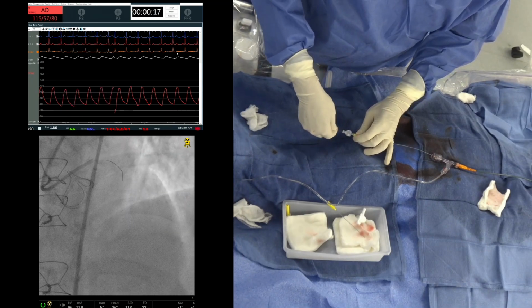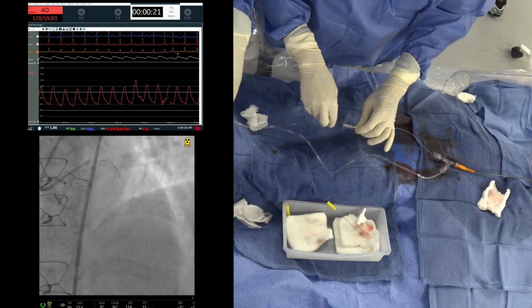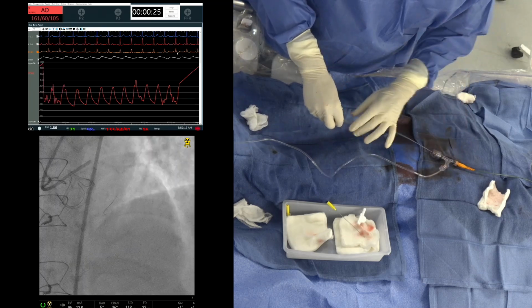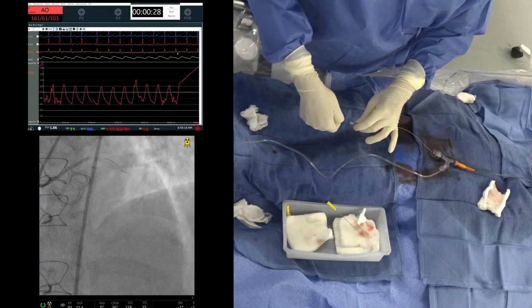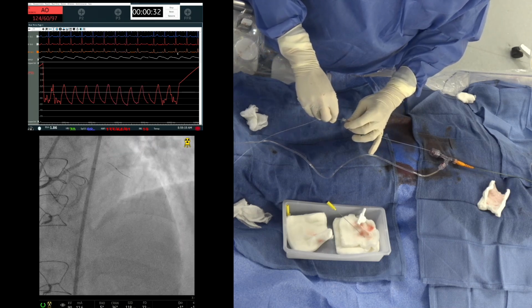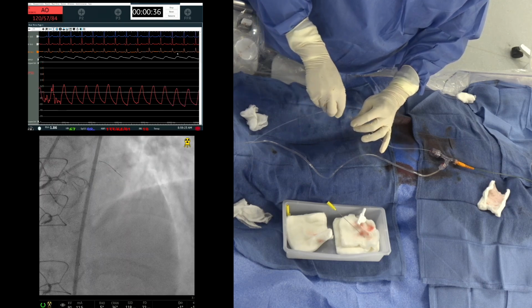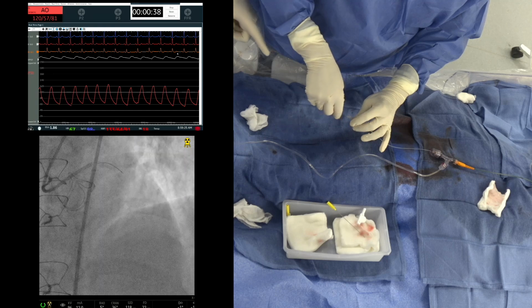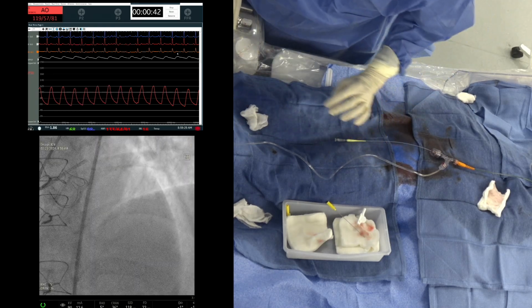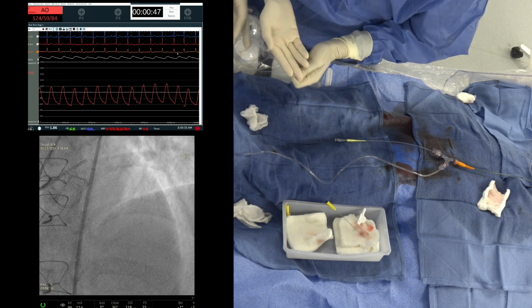It doesn't matter if you want to change the tip. Okay, give me the Fielder wire, I guess. It's taking too much time. It looks like it should go easy. But I think you want to change the wire tip here. Why are you going to take a Fielder or a normal wire? Look at the tip.